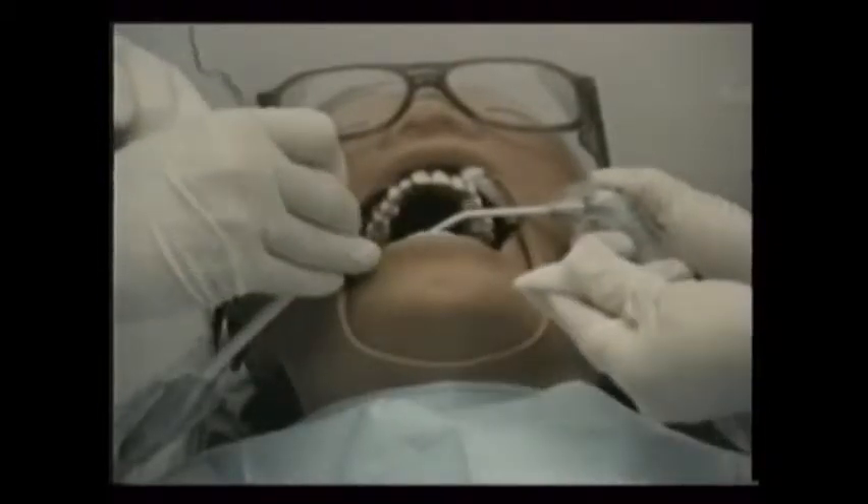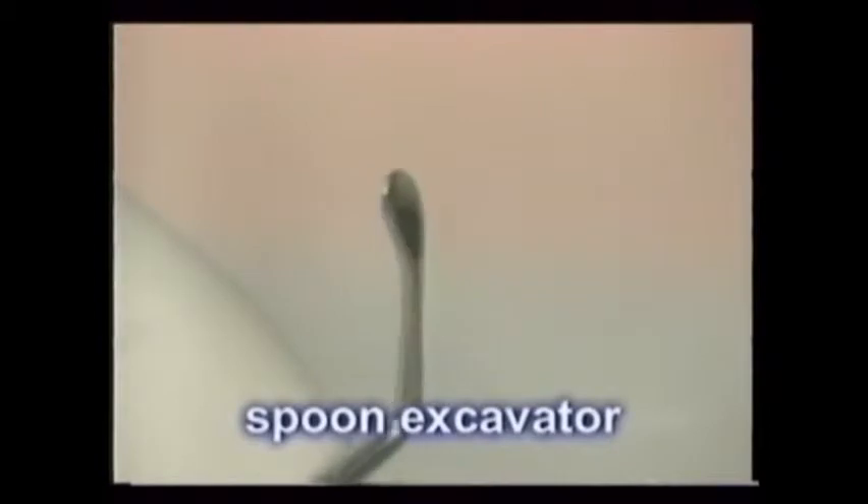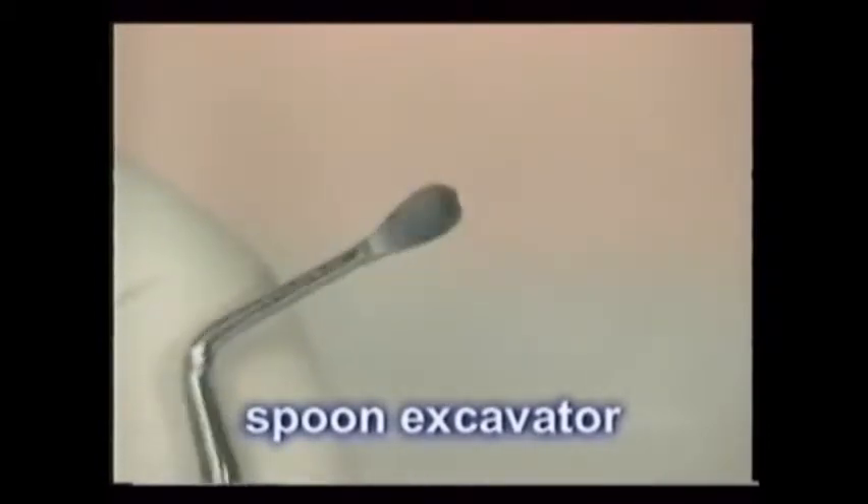Once accessed using high-speed burrs, the soft decay is removed with both large round burrs and a slow-speed handpiece, and using hand instruments called spoon excavators, like the one shown here.